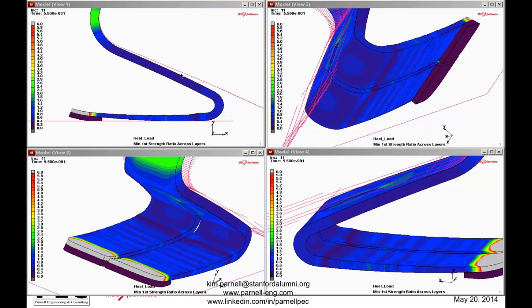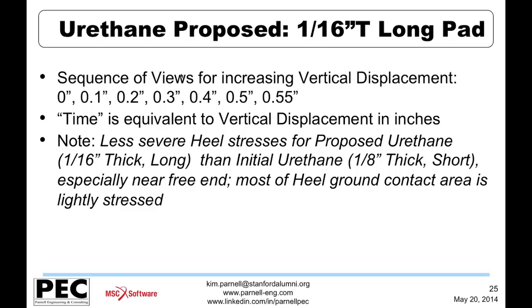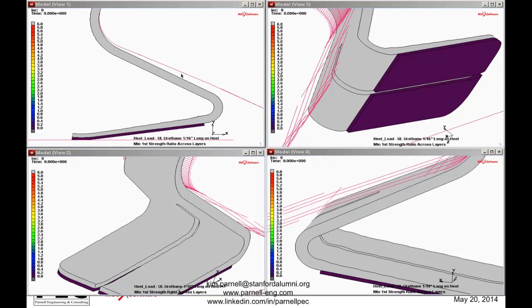What I am looking at here is the overall strength ratio. So the first strength ratio, we'll look at it again here on this view. So now doing the same thing with the longer pad. Since the strength ratio is essentially a ratio relative to your specified failure and strength criteria, you can have Mentat provide just the minimum strength ratio. Some failure criteria will have multiple criteria to evaluate. Tsai-Wu, for example, is a single scalar criterion.